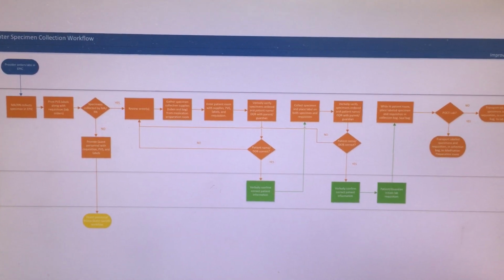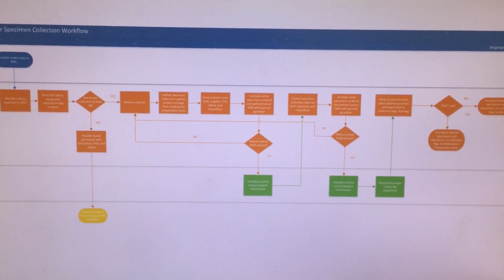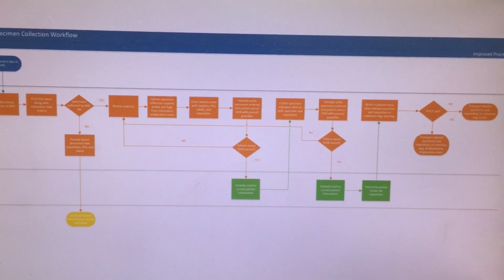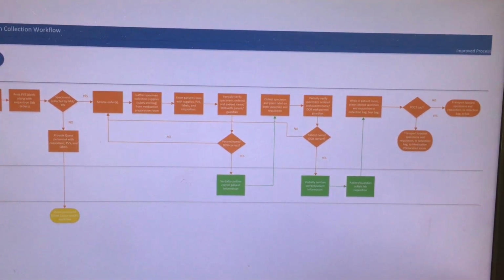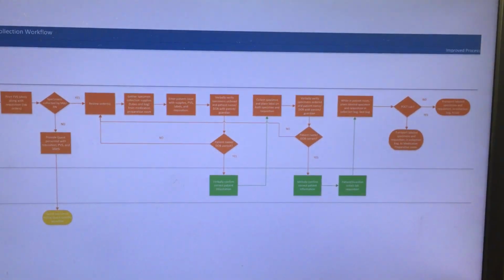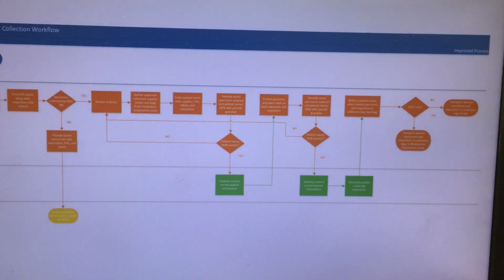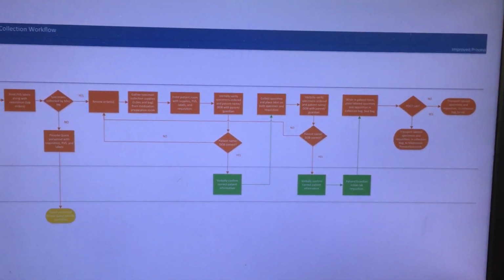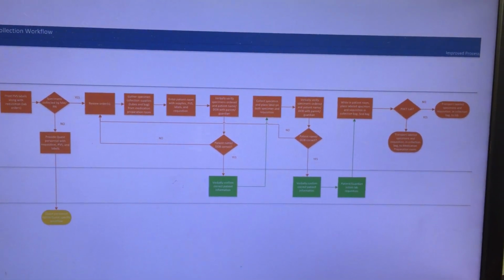Hello, Miss Alvarez. I'm here to draw labs for your son, Edgar. And she says, okay. And then you say, can you verify with me that we are going to be today completing a complete blood count on Edgar? And can you please give me Edgar's name and date of birth? She says, yes, we're doing a complete blood count on Edgar. His name is Edgar Alvarez. His birthday is 1/1/2010. Can you please spell it for me? She spells the name for you and she gives you the date of birth once more.